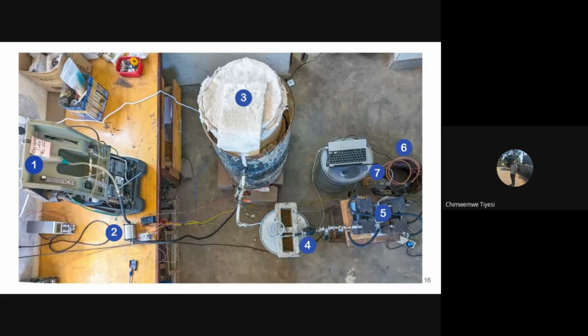The electric heating element was installed at the base of the heating drum. Dry air is generated using a modified oxygen concentrator, as I said, with zeolite replaced with an alternative desiccant in the sieve bed of this concentrator. And the dry air was introduced into the crucible at a rate of 20 liters per minute. The duration of the process ranges from 3 to 6 hours, depending on the quantity and also the moisture content of the zeolite prior to regeneration.